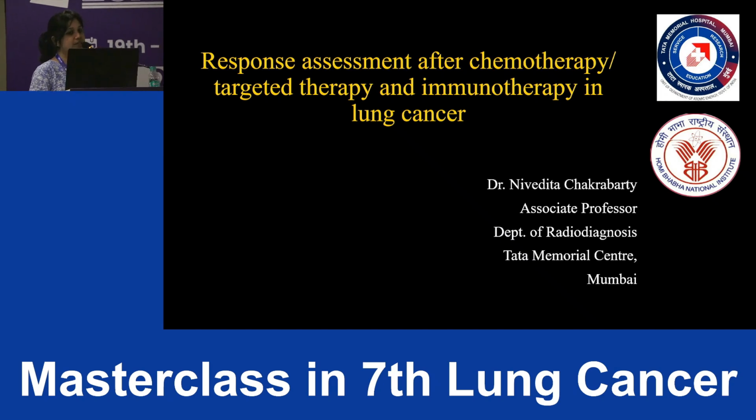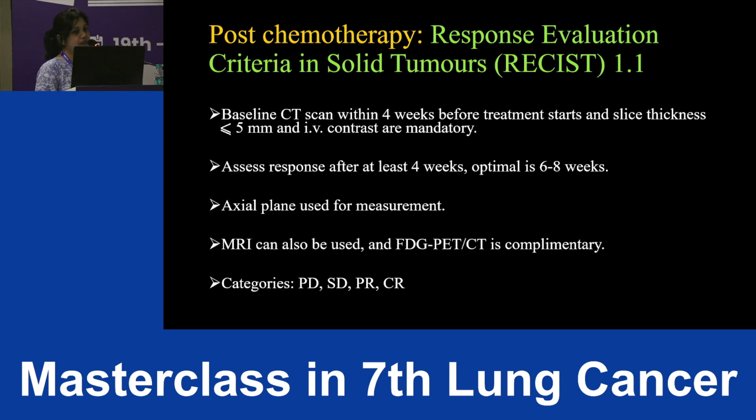Response assessment after chemotherapy, targeted therapy, and immunotherapy in lung cancer. We use the criteria Response Evaluation Criteria in Solid Tumors, the current version being 1.1, for assessing response after chemotherapy.